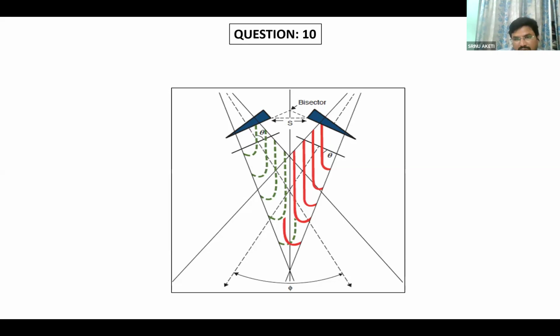Not the central axis. Many people will say central axis, but it's wrong. It's the angle between the tilted isodose line and the line perpendicular to the central axis. At any depth, you have to say any depth? No, sir. You can say at any depth, or you have to mention a specific depth, such as Dmax or at 10 centimeters, sir.